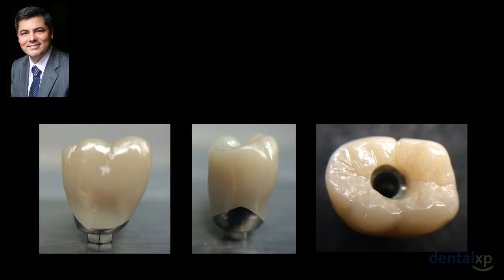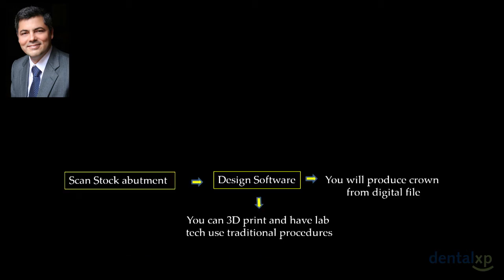This is not equivalent to what my technician is doing in my practice. I pretty much don't like the anatomy. I pretty much don't like the finish, and I'll show you what I mean with that later. So when you are working with this and you forget about glazing, you forget about staining, you forget about crystallization, you are giving away a lot. And you have to decide if that's how you want to do it. You might be in an environment in which that might be the way to go.